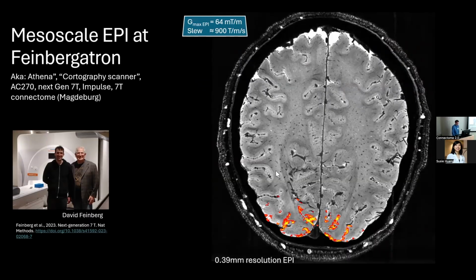But nevertheless, we were quite happy when we got those kind of images that are already maybe 5 years old or so, because at that time it was unprecedented resolution. And for me personally, it really lifted the curtain to a new world of mesoscale imaging, to see all these interesting details down there. For example, we have these conventional fuzzy blobs of activity, but then also we have these very fine scale blobs, the diving veins coming in. We have layer features, and then also we see surprising things like these negative voxels that deserve more attention, and I want to talk about.